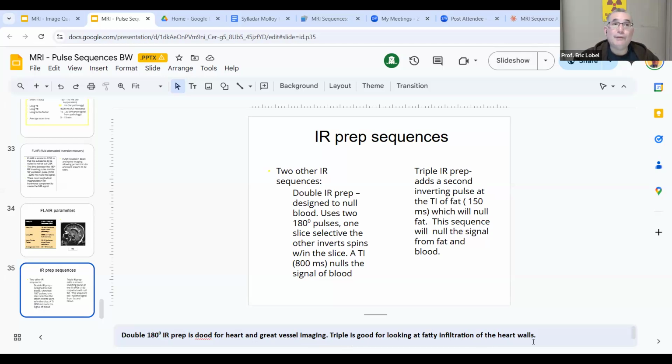You will discover that when we start to touch a little bit, we don't even barely scratch the surface of cardiac imaging, but we do talk about gating. And you really need to know what you're doing when you're doing gating. It's not just setting up the leads. That's the easy part. It's like running the software and all that stuff.